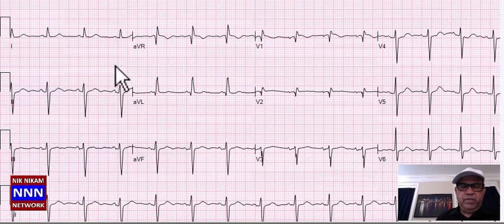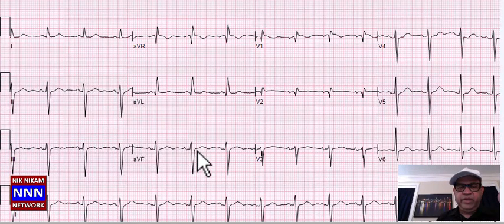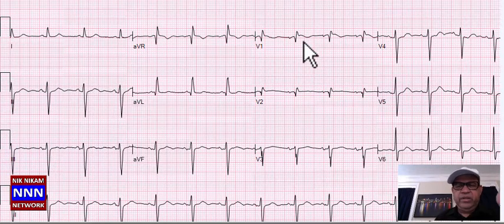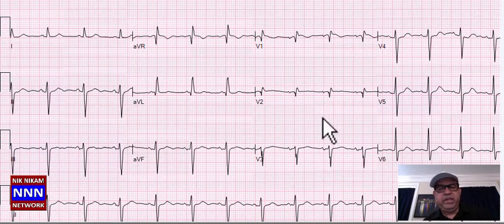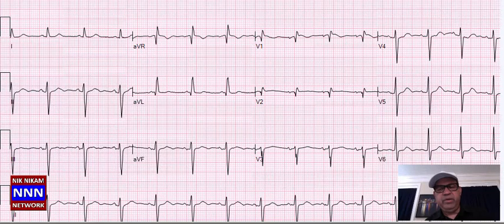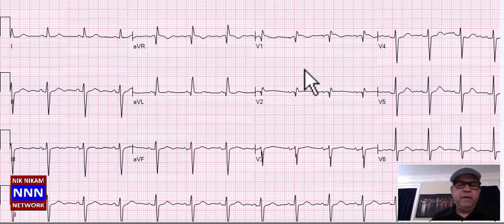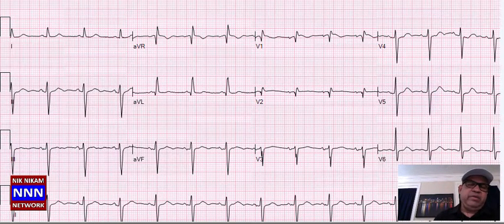We have sinus rhythm with left axis deviation, non-specific ST-T changes in the inferior leads, possibly incomplete right bundle branch block with ST-T changes throughout — a sort of abnormal electrocardiogram.